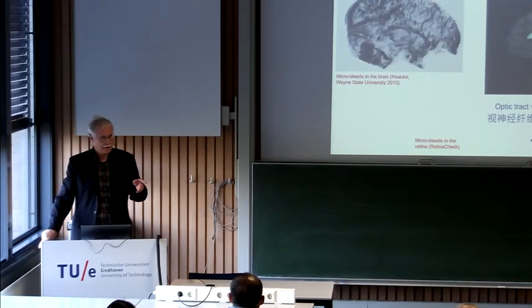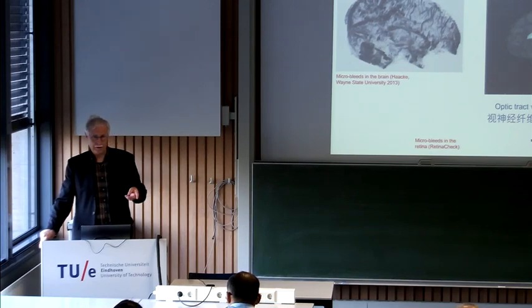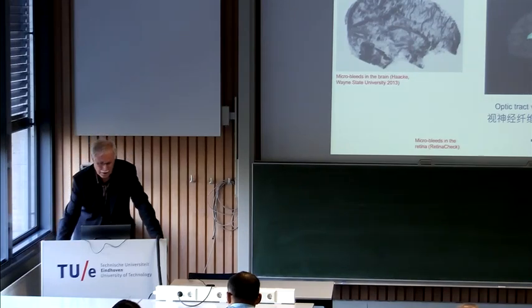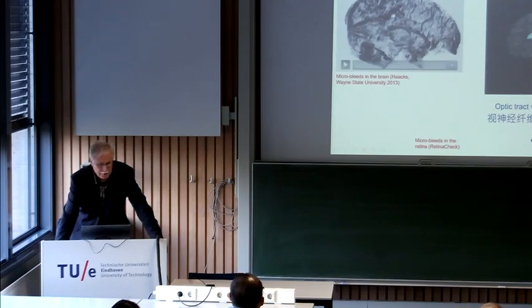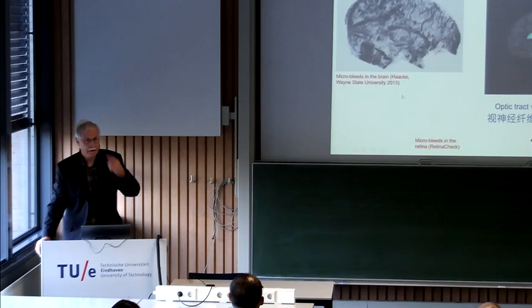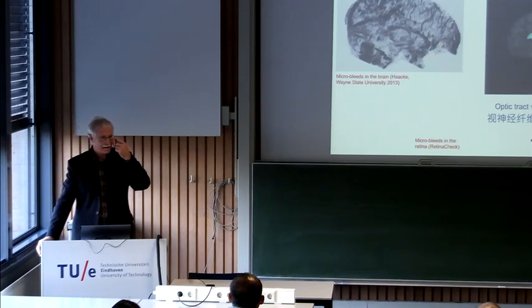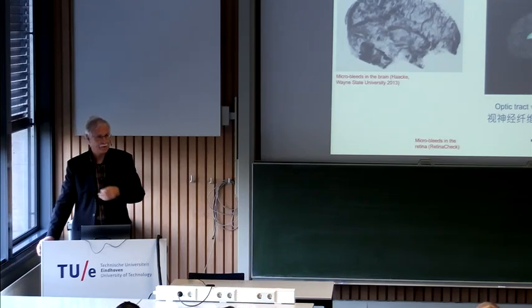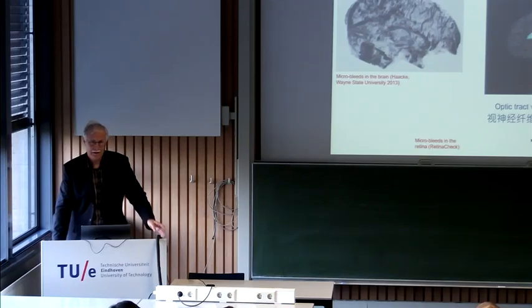So people are now studying relations with the development of early neurodegenerative disorders like Alzheimer's, depression, dementias. And what we like to do is, of course, if you take a 500 euro MRI scan and you compare it with a 1 cent scan of the fundus and it gives the same information, what do you take? Especially when you screen the whole population, you want to go to this fundus. So there's a very interesting role for the retina to see how informative it is.